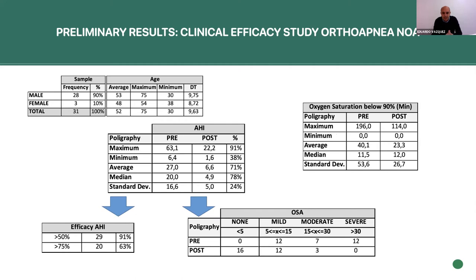A second question that came in was whether the device can be built with an anterior stop and no posterior contact. So could you comment on that?